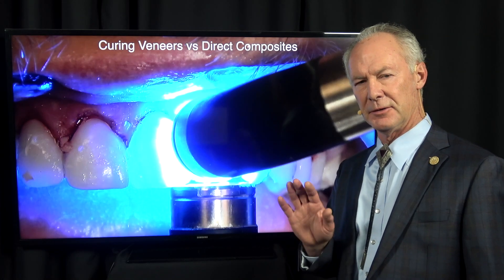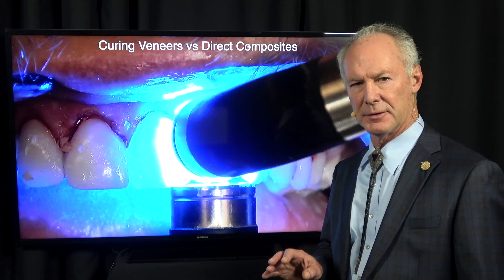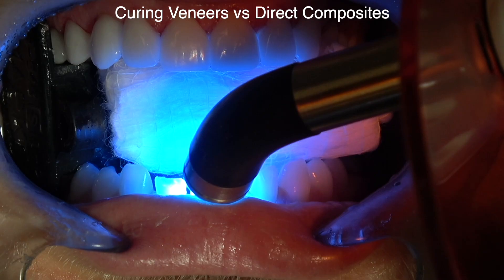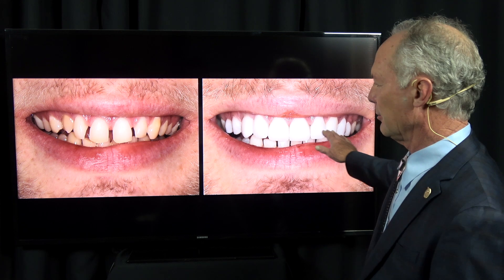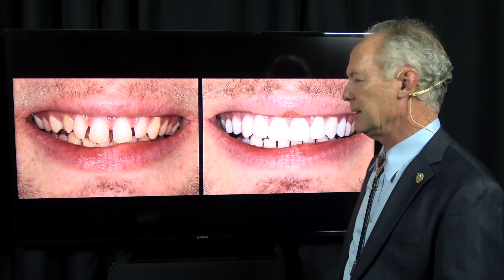Hello, what's the difference in curing the primer adhesive and the luting composite when you're placing a veneer versus curing the primer adhesive and the direct composite when you're placing a composite directly on a tooth? I'm going to talk about this case. I've placed veneers on this young man's maxillary anterior teeth and bonded the chipped incisal edges of the mandibular anterior teeth.